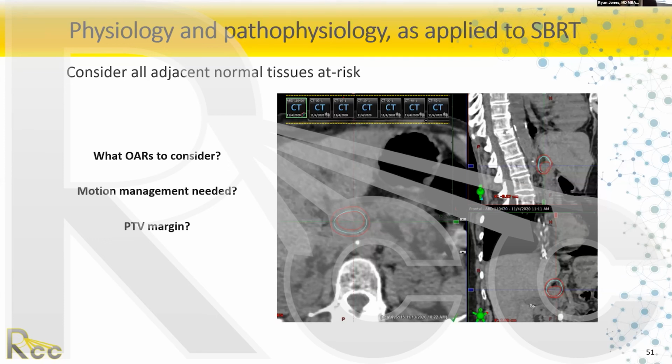She was treated definitively. It had been about a year. This showed up avid on PET CT. They thought it too risky to biopsy. It had an SUV of 9. It was very radiographically consistent with disease. We treated her. She's now out another 1.5 years with no evidence of disease.